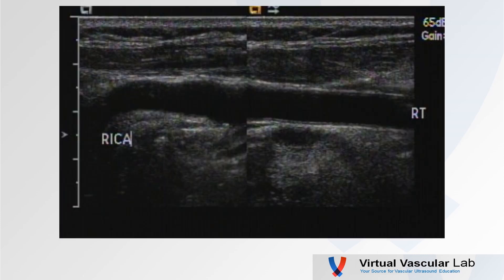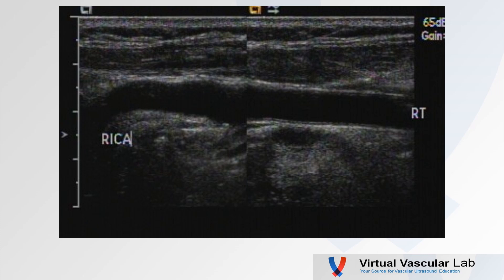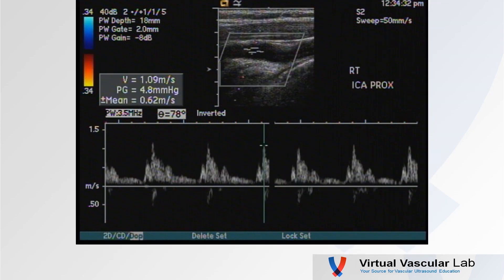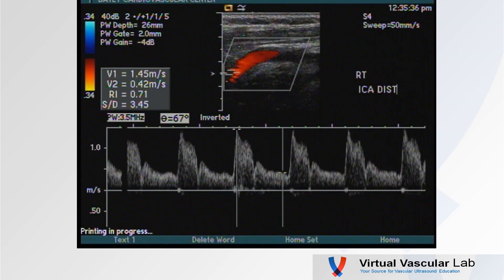Here's a pretty nice image of the distal common and right internal carotid artery — they look pretty good. A spectral from the distal common looks basically okay. A spectrum from the proximal ICA shows a velocity of 109 — not too bad. And the distal ICA — wow, look at that velocity. What's going on there?